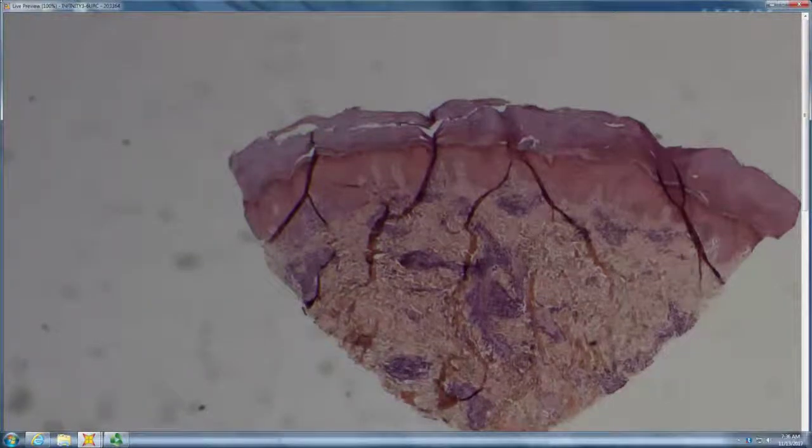No. So that means the endothelium is swollen. What you don't see is big endothelium. What you see is absence of lumen. Right, so that's swollen endothelium. So pretty dense, superficial and deep lymphoid polymorphous infiltrate with endothelial swelling. You usually think of.